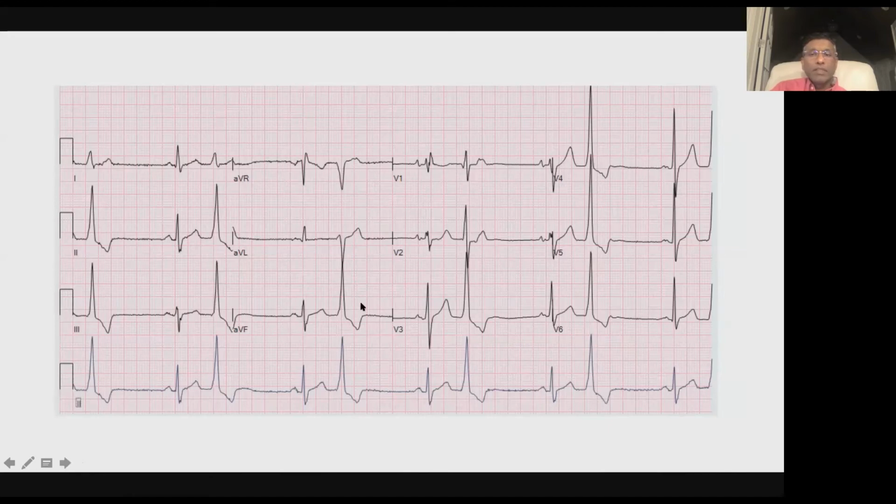And maybe one more. And here, same volunteer can stick around for this one. Just focus on V1. I'm going to walk you through this. It looks like sinus rhythm here, P, QRS, P, QRS. And then you're given this tracing and your intern is asking you, are these PACs conducting with bundle branch block, or are these PVCs? What do we do for this patient? Should we give them something for ventricular arrhythmia, or what is this? And so that's your problem to decide.